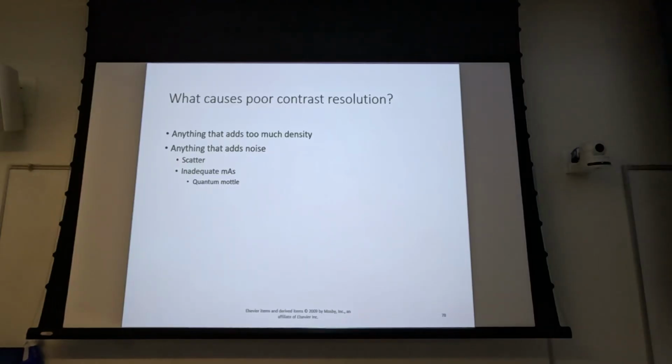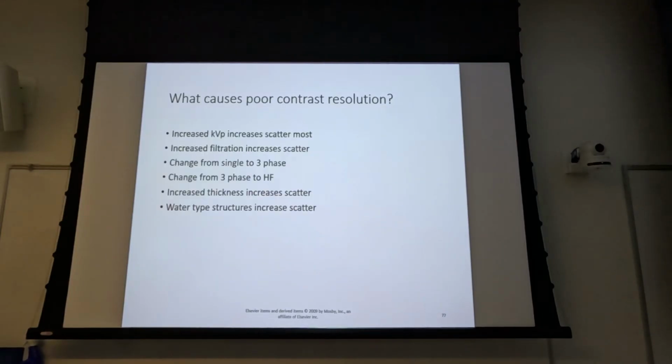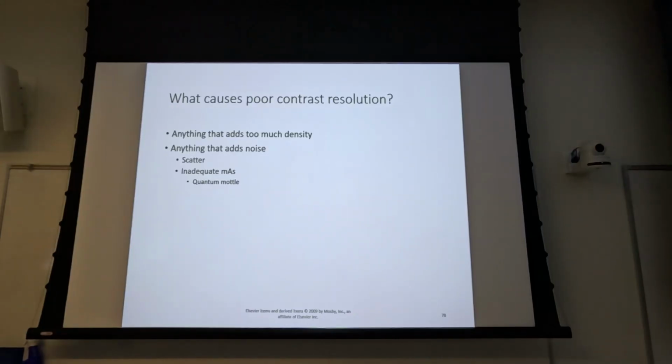So it's going to be the lookup table, the computer algorithm. If there's anything else, it would be tissue thickness, but that's just the patient. So the machine factor is always going to be the computer algorithm. Potentially, I'm going to throw this in there too: potentially grid use and collimation.